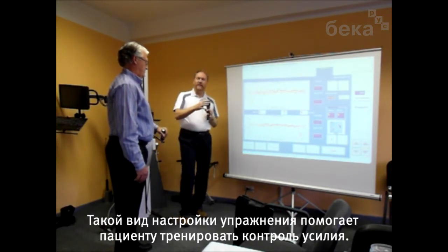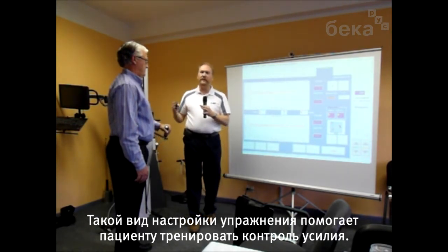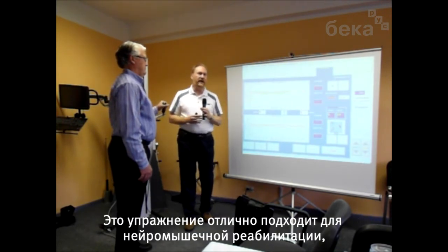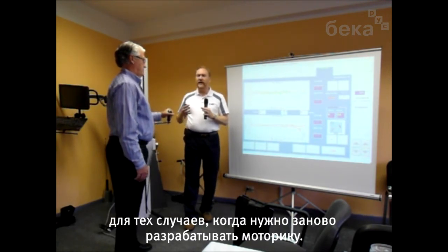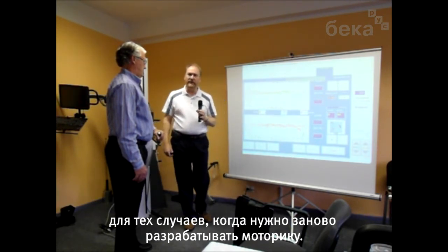So what this type of setup does is it helps retrain the person to control their force output as they're moving through range of motion. It's very good for neuromuscular re-education, working with stroke patients, CVA, head injury. Anytime they have to relearn motor control, this is a very good training tool to help them accomplish that.